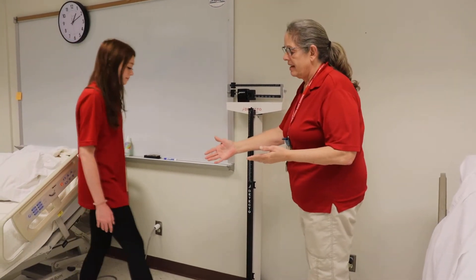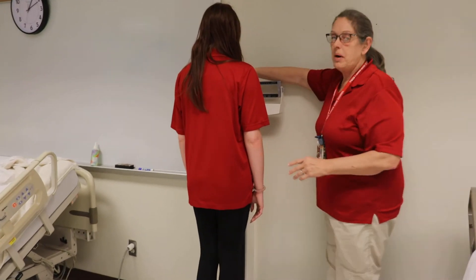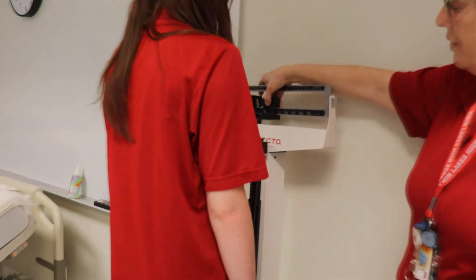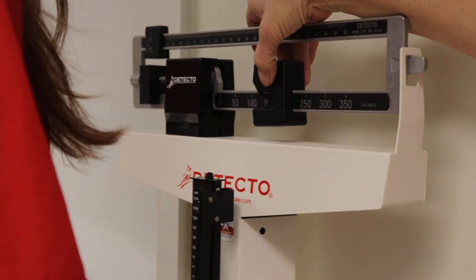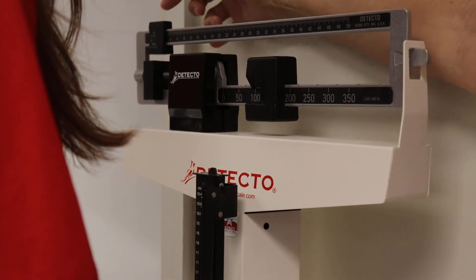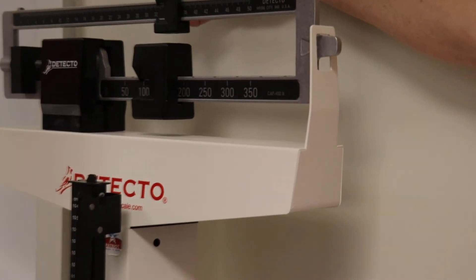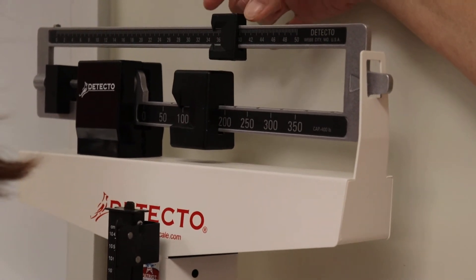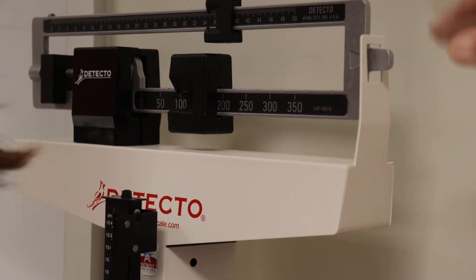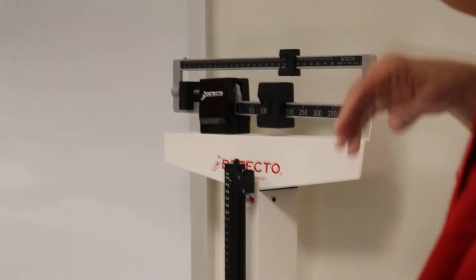I would then have the patient stand up onto the scale, and I will move the bottom weight over one at a time until it drops, then take it back one, and then I will bring this over until it balances. Once it's balanced, I'll have the patient step away and I will document it.